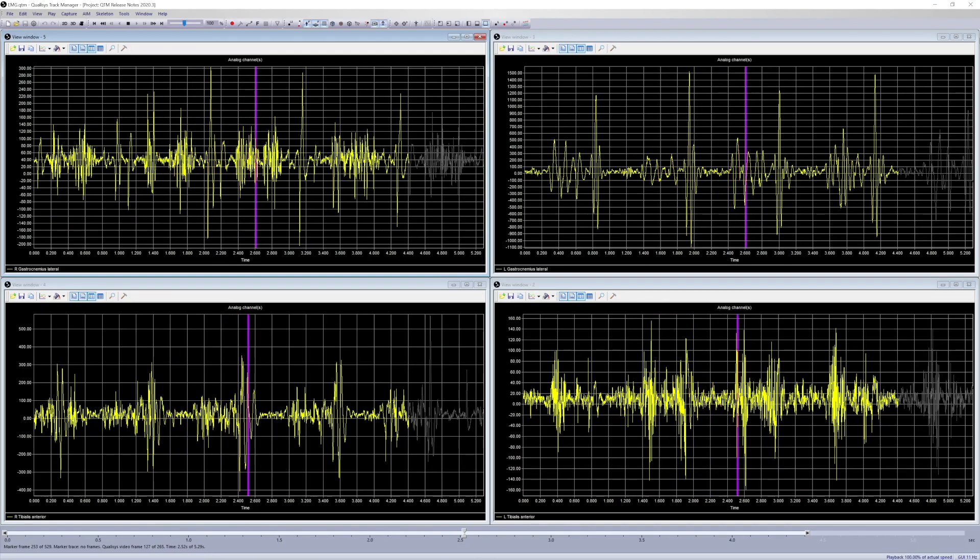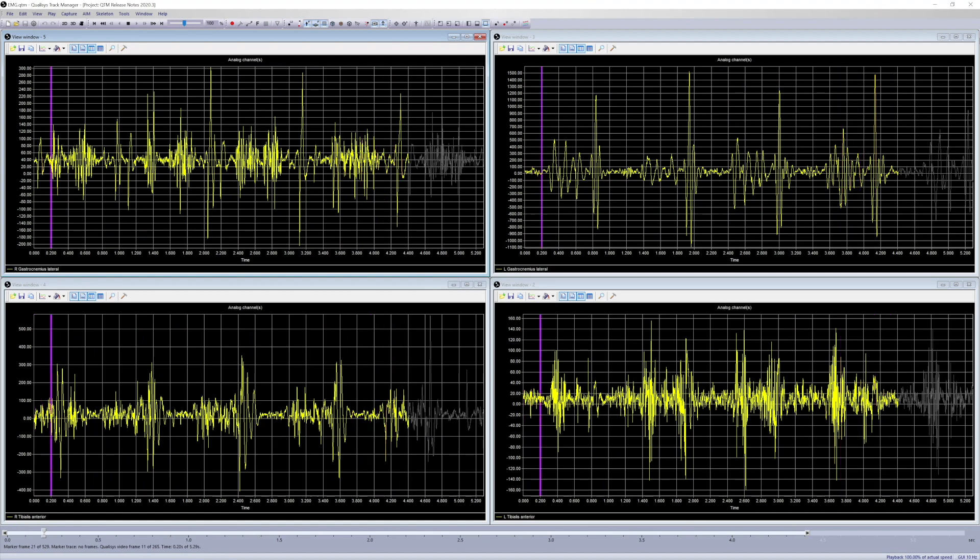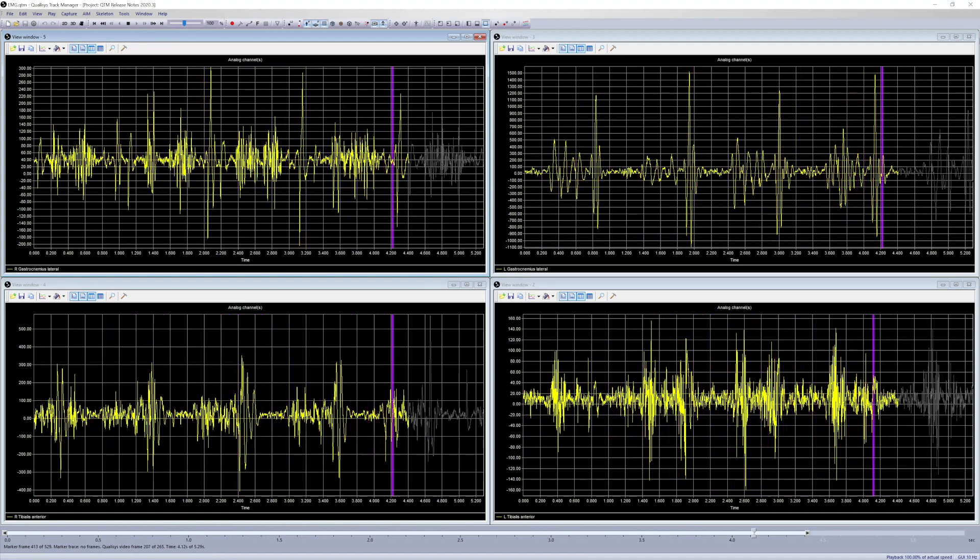QTM's Delsys integration has been expanded to support the Avanti Sprint, Mini, Snap, and EKG sensors.